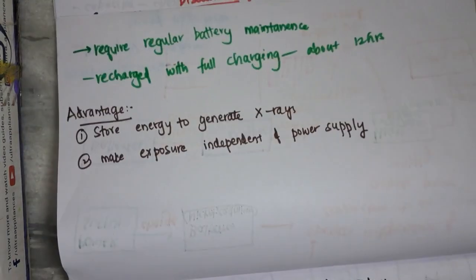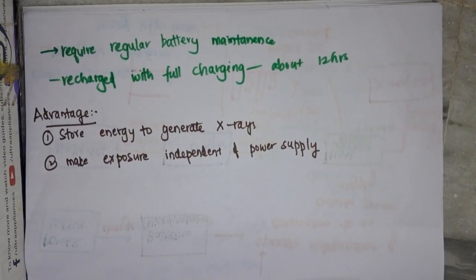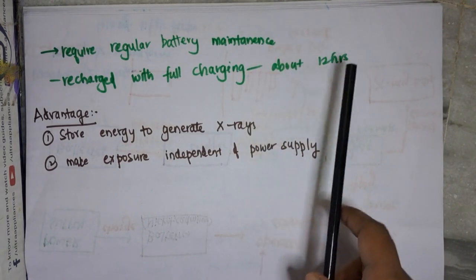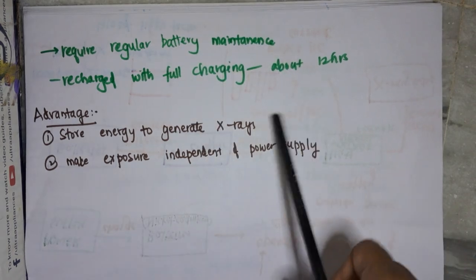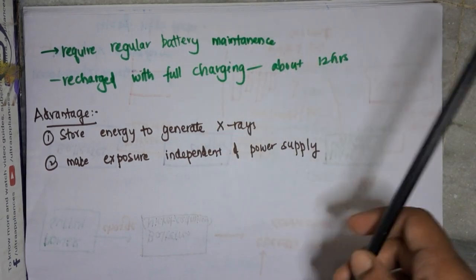So the battery powered portable unit is heavy and requires regular battery maintenance. This can be recharged fully from any convenient power supply, and full charging requires around 12 hours.